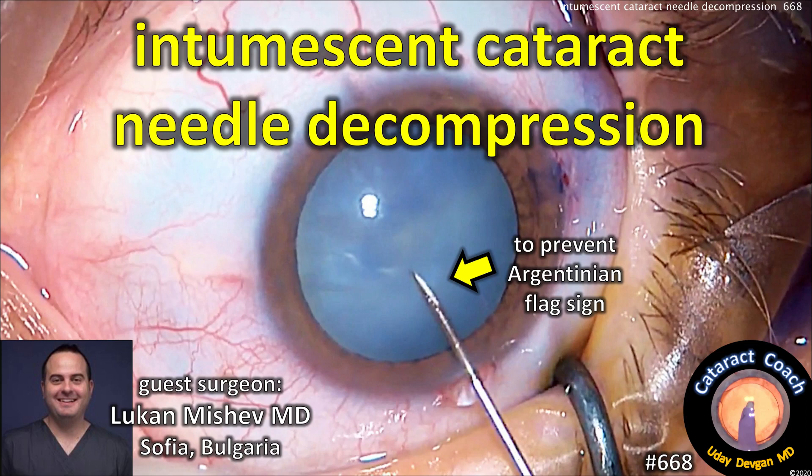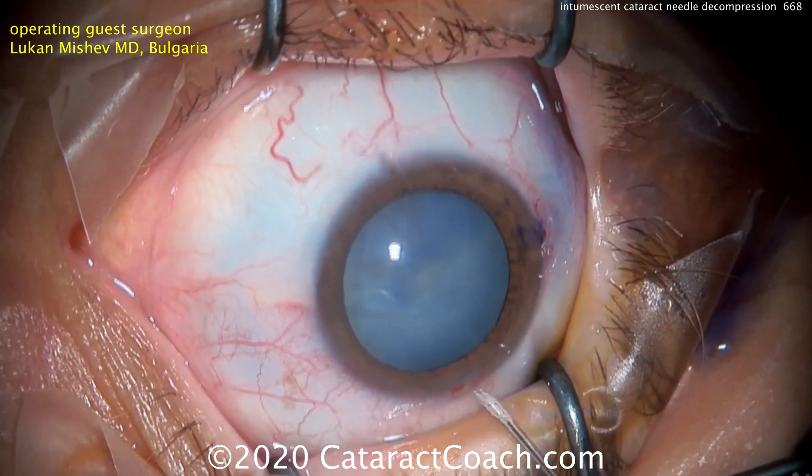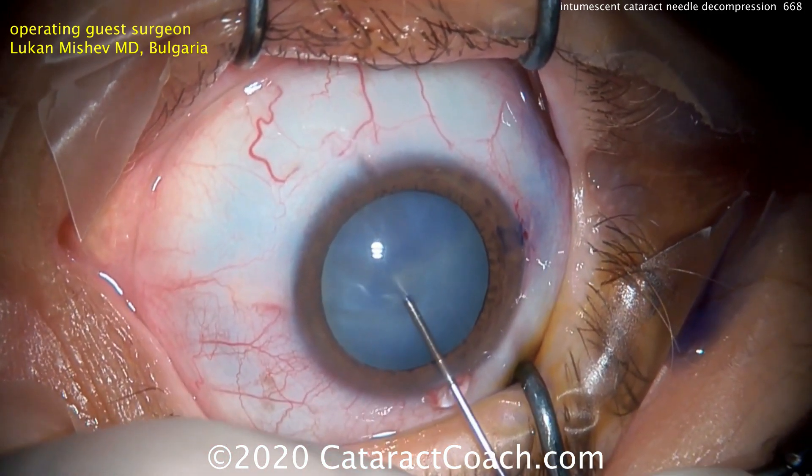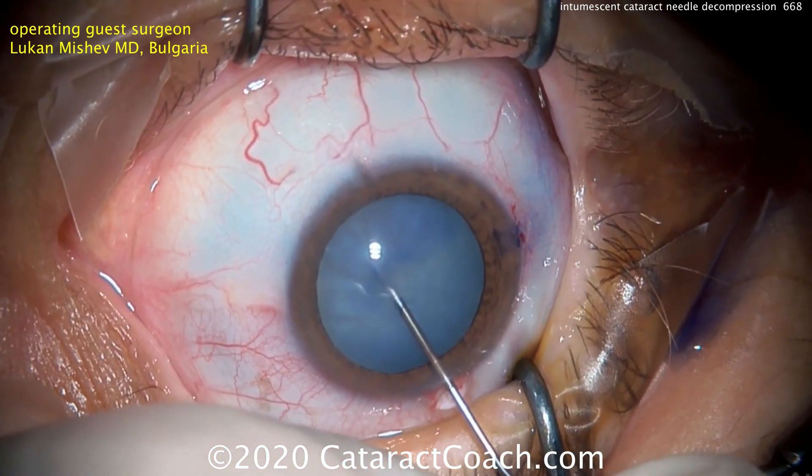CataractCoach.com presents intumescent cataract needle decompression with guest surgeon Dr. Lukan Mishev from Sofia, Bulgaria. The idea here is to get the fluid out of that intumescent cataract before starting the capsulorhexis.